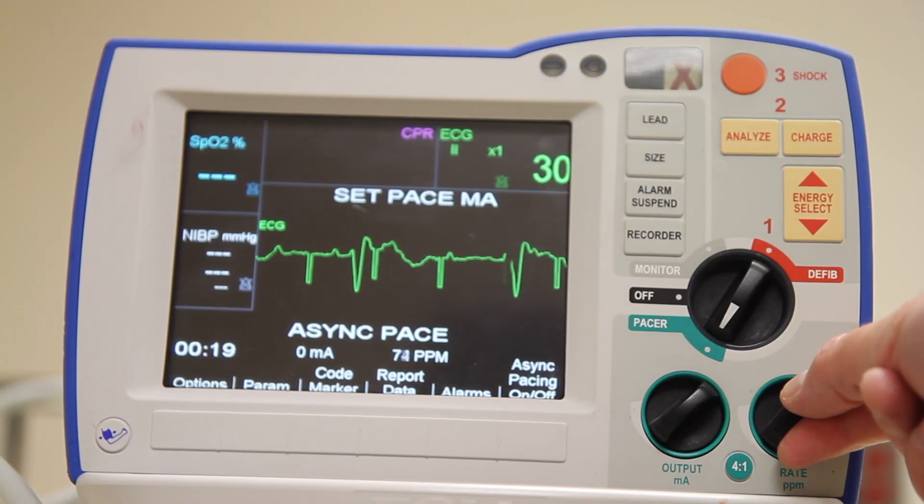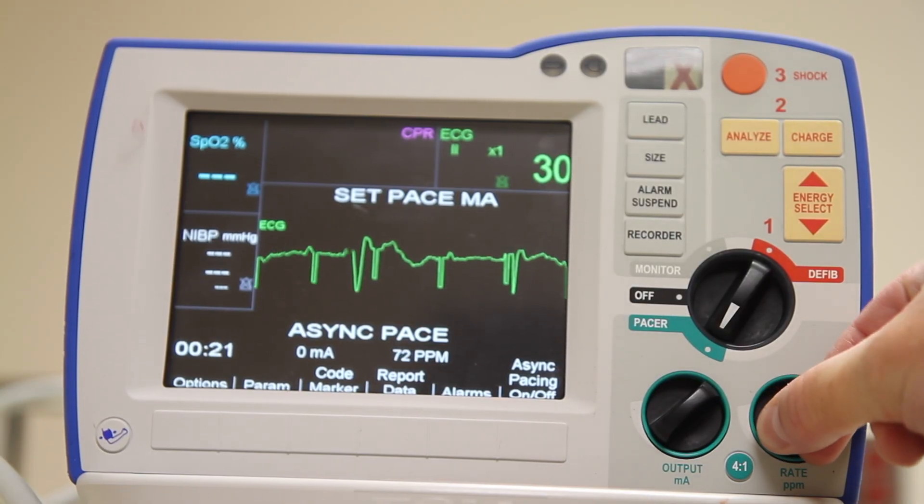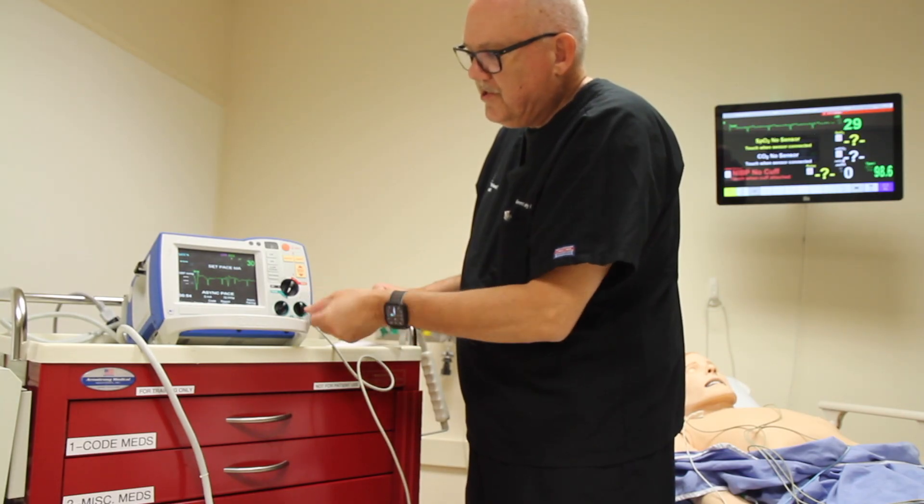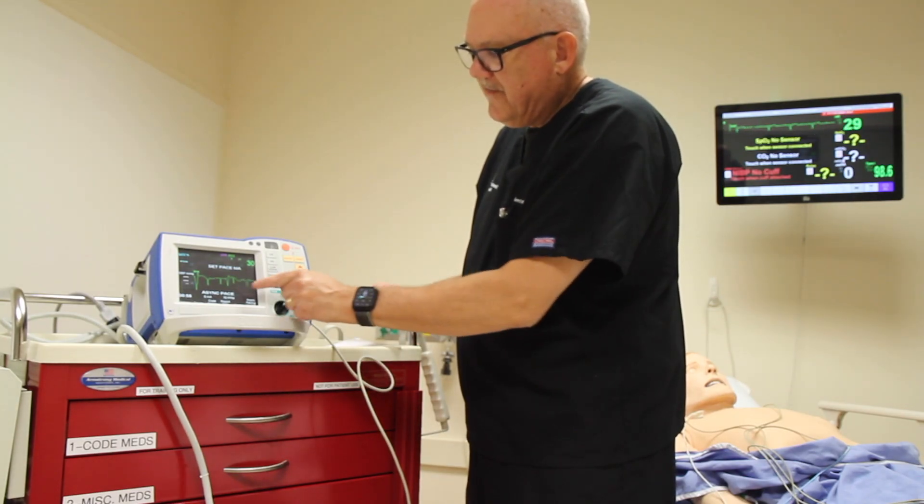Next we're going to set the rate using the rate dial. We can dial it up or down as we need to. I'm going to set it to 70 beats per minute.